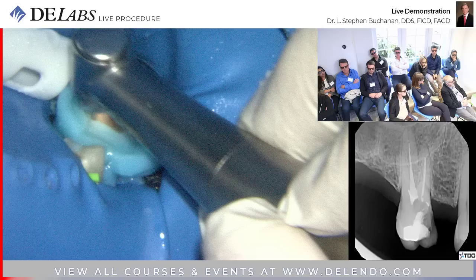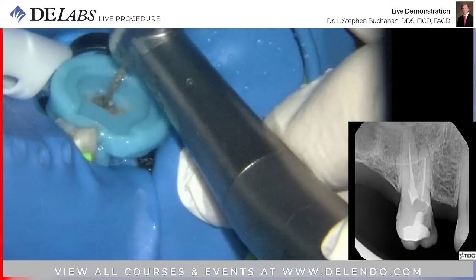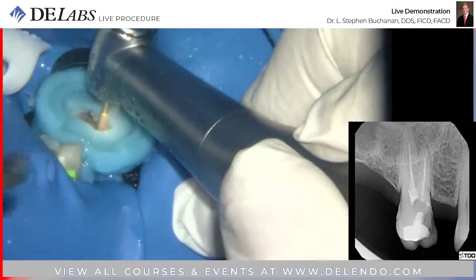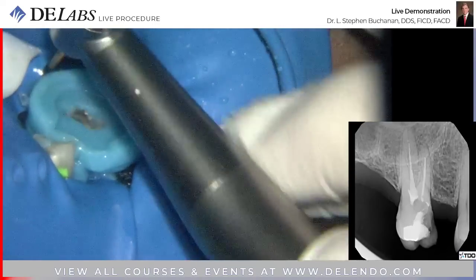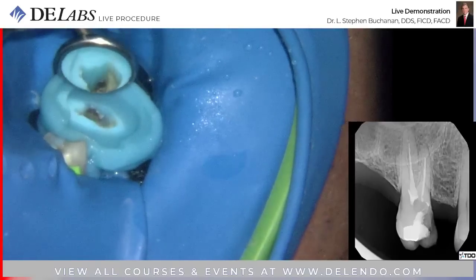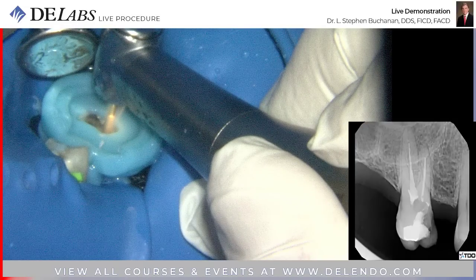Now you're just making sure you see the tops of the panels again, right? Pardon? You're just trying to make sure you see the tops of the... Well, and I need to see a nice transition here between the tooth and the material. No overhangs. Like this isn't removed down low enough. Air. Okay. Almost there. I don't want to overcut it because I have almost no tooth structure down there. Cool.